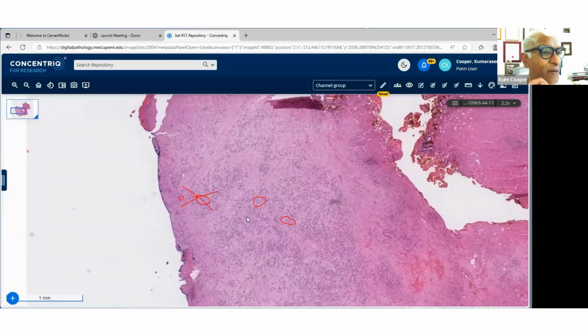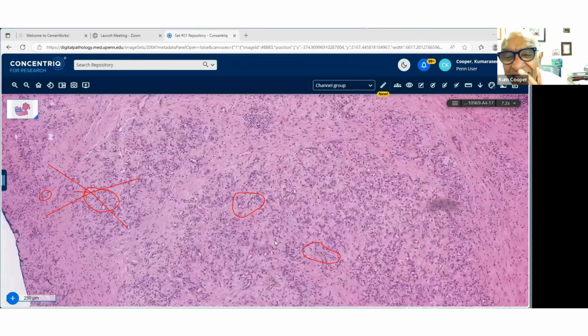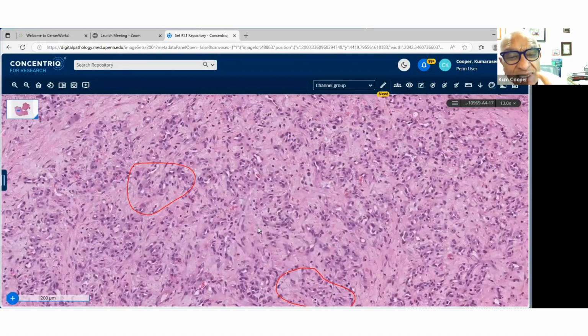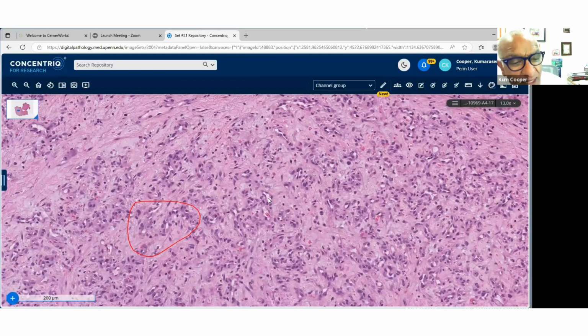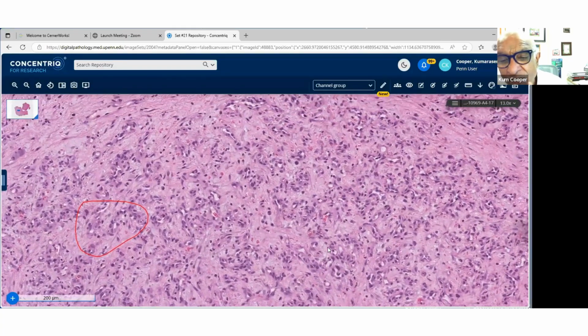Okay. All right, so we're seeing Kaposi sarcoma or Kaposi's. I like that. Ooh, I love this here. Bacillary angiomatosis. I love that. So KS, let's look at KS, okay? KS is lobulated as well. It's kind of a giveaway. They form slit-like spaces. You do get vascular changes typically in the periphery of a KS. This is within the lesion. This is within the lesion. Well-formed vessels, small vessels opening up their lumen, well-formed.